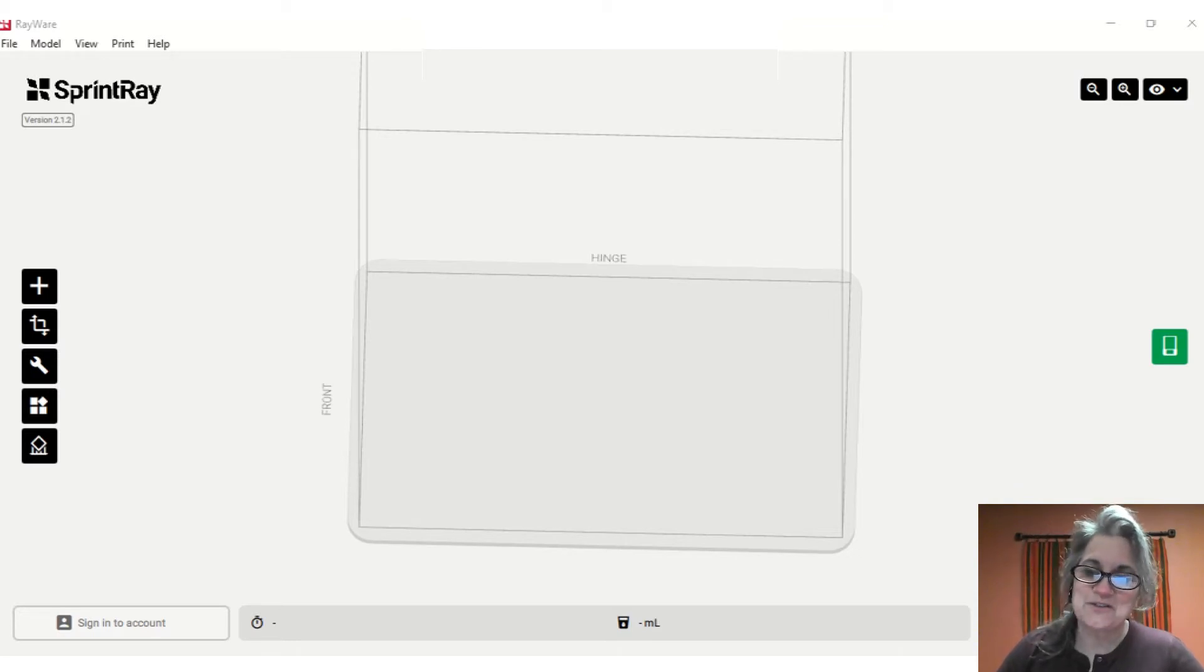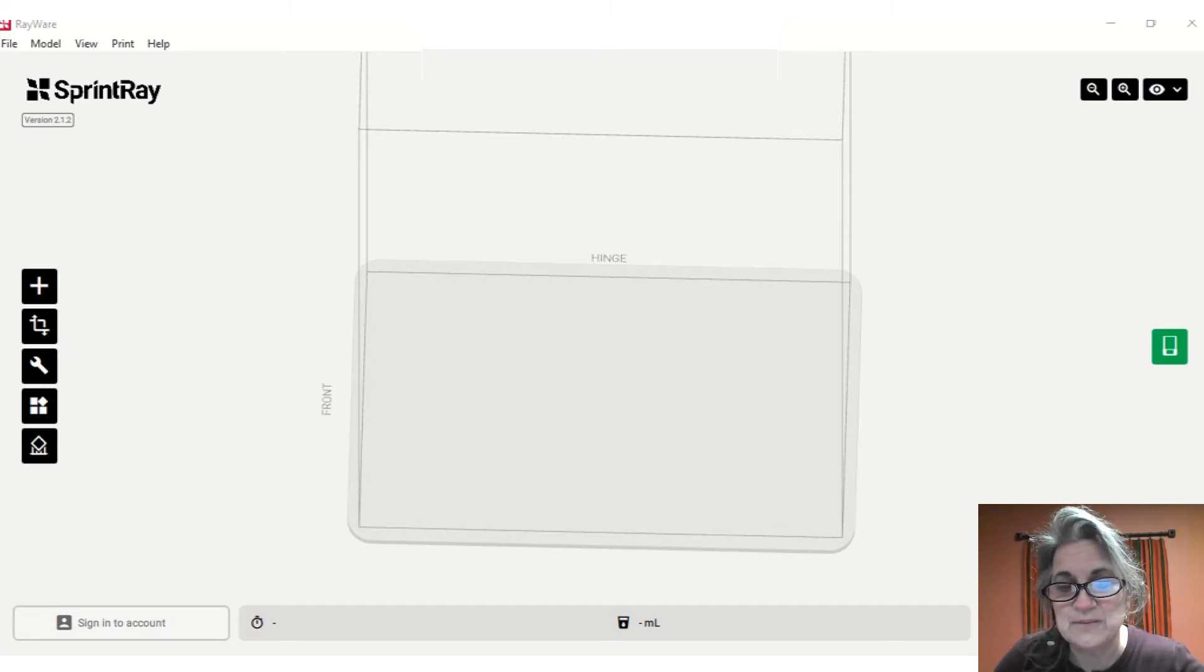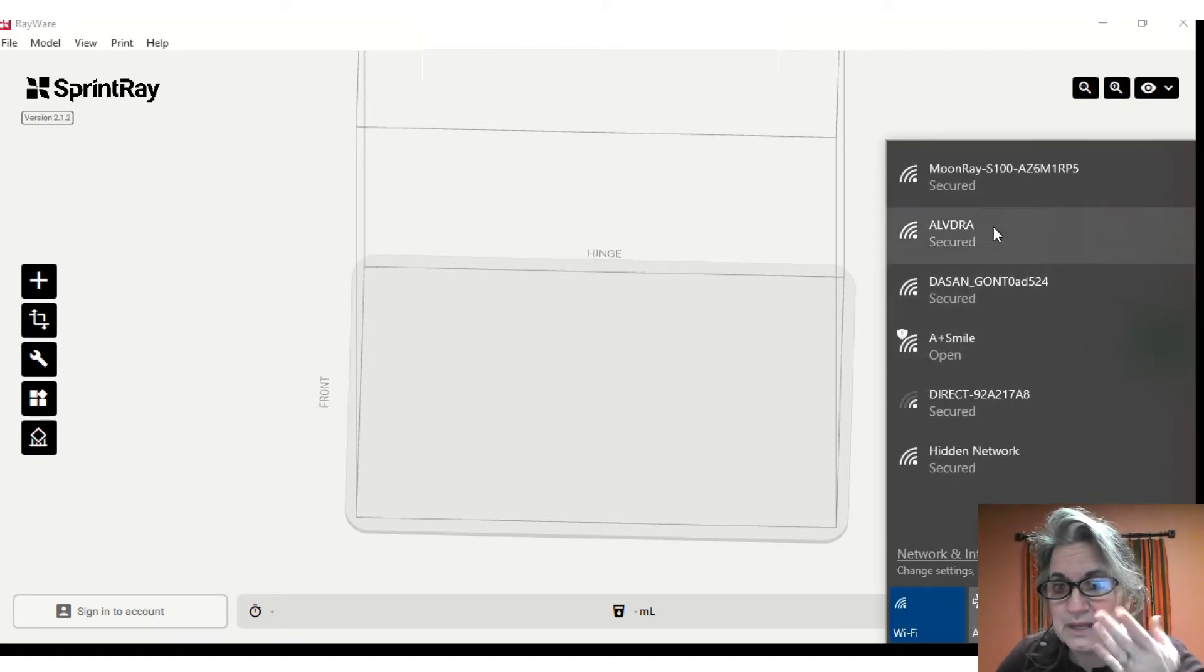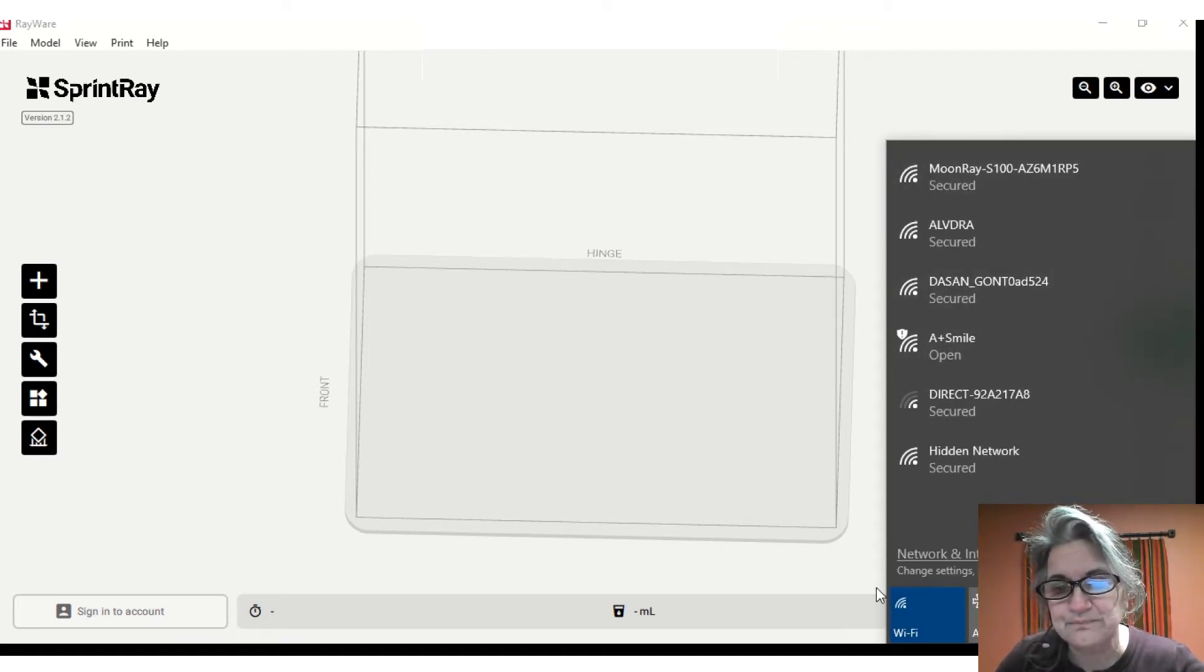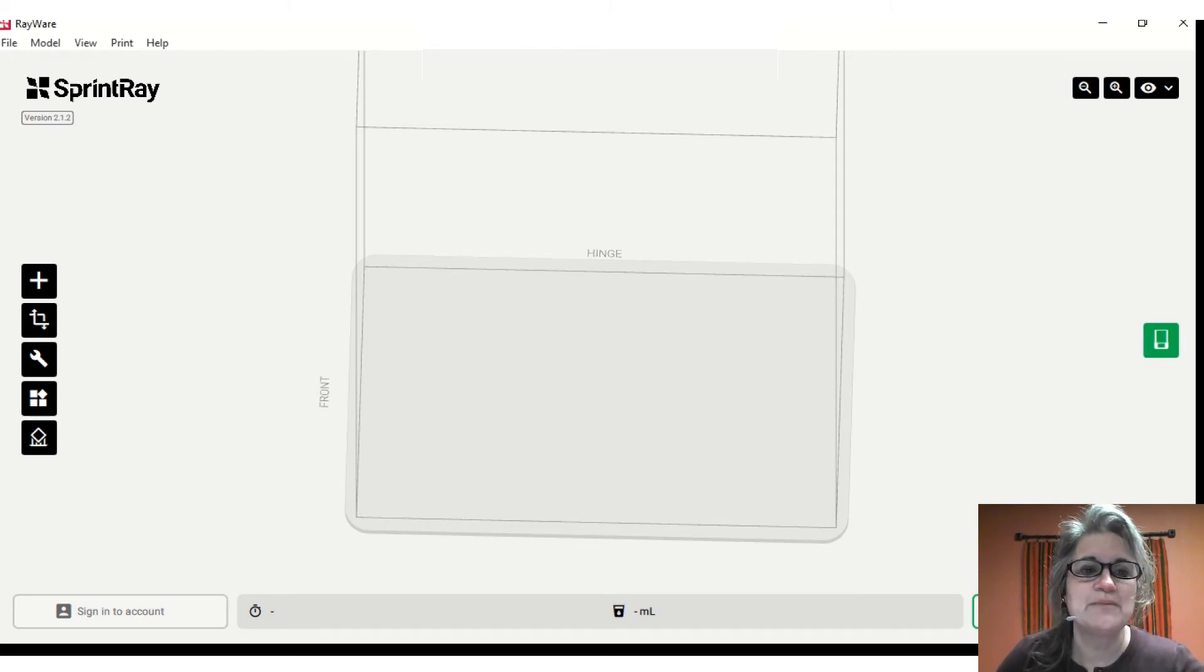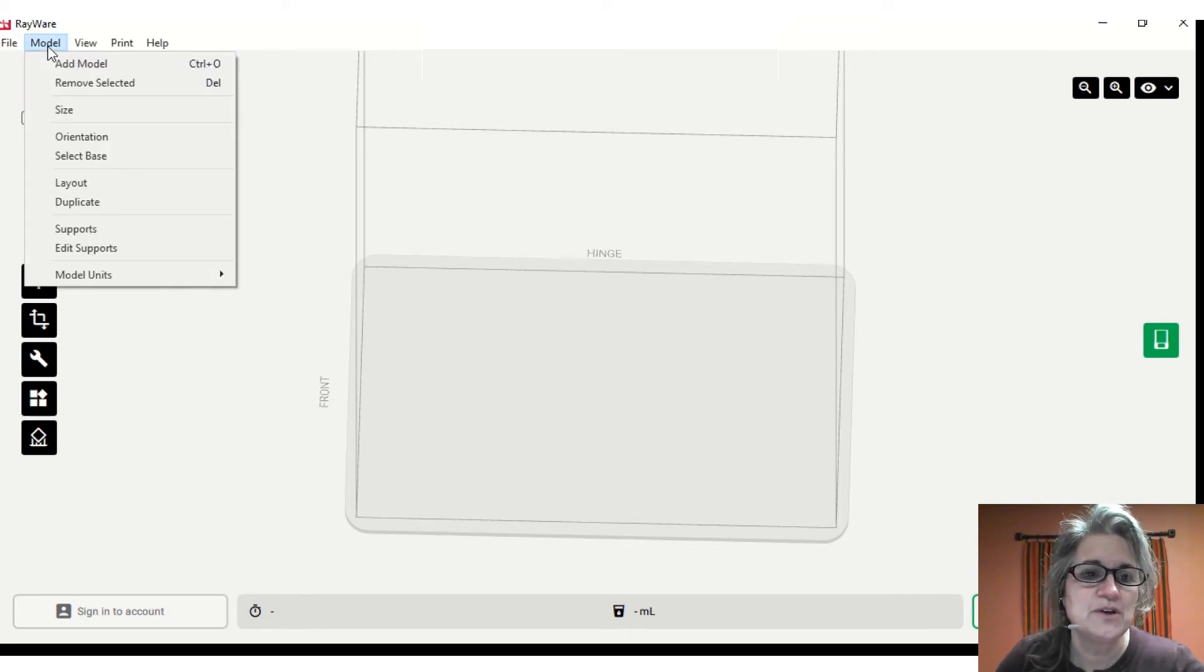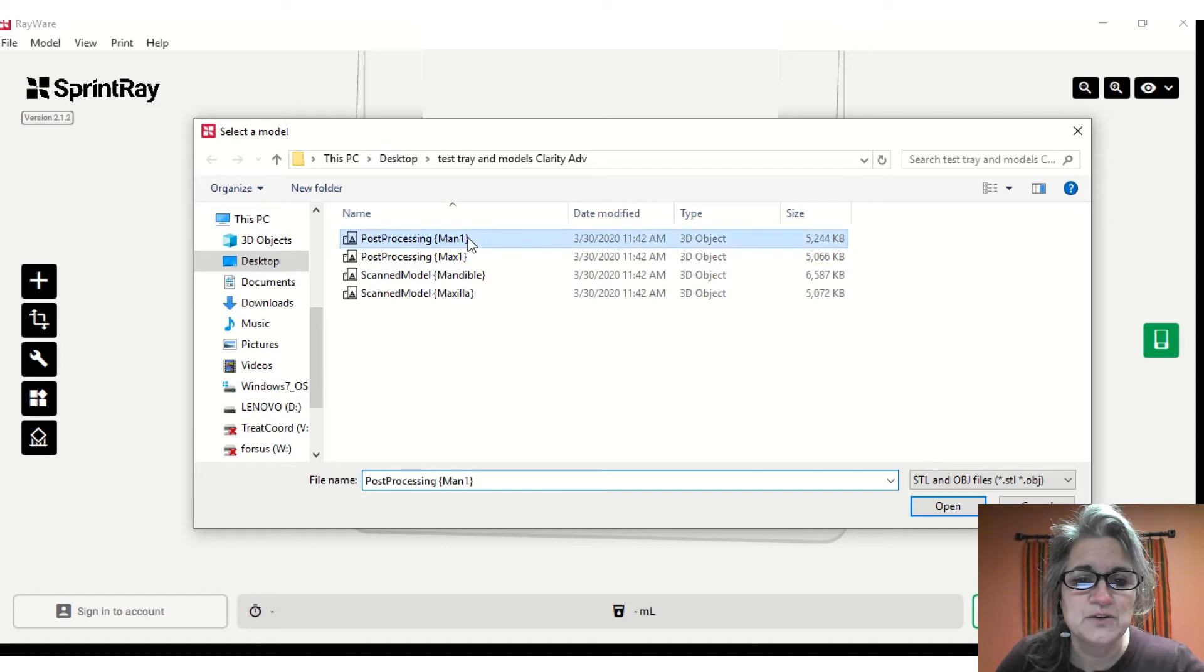One of the first things I always like to do is check that my printer is actually on and make sure I'm connected. We run our SprintRay off our office network, but our MoonRay we like to run just direct, so I'll make sure that I'm connected. Then it's very simple - I'm just going to add my model. Wherever you have exported the STL files from 3Shape, go ahead and select the models you're going to want to be printing.